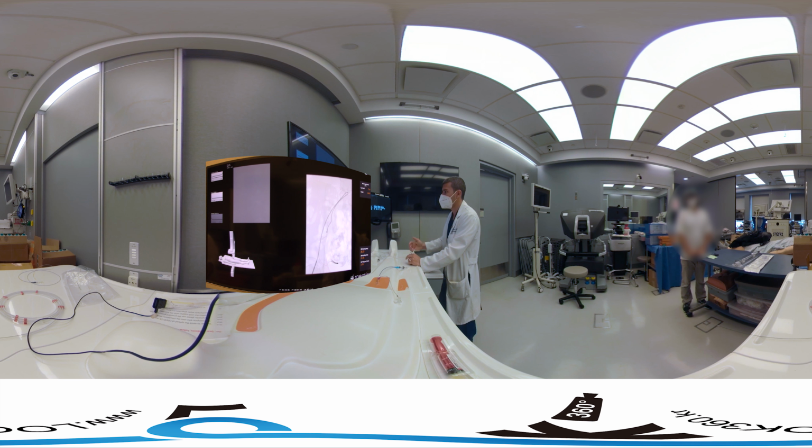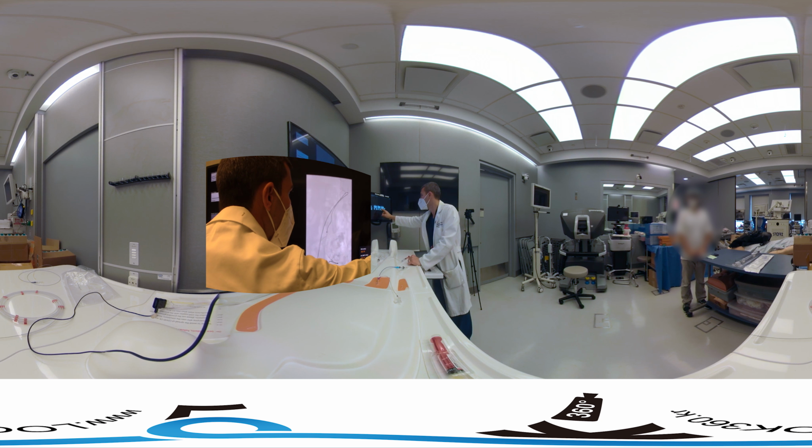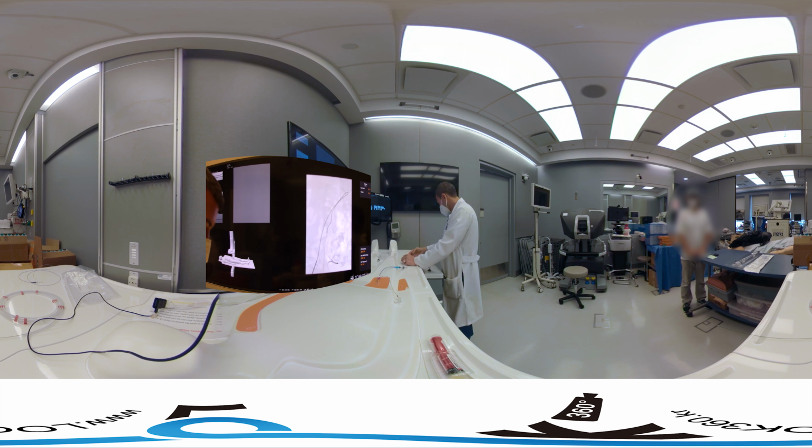I'm starting to get reflux, and you can see how slow this is transverse, and we see good staining in the uterus actually. I'm going to try to just get a little bit more in without getting too greedy. And I think this is a good endpoint for us. All right, so we'll stop there. What we're going to do though is flush out our catheter, because there's still little particles in there. So we're going to flush this out.